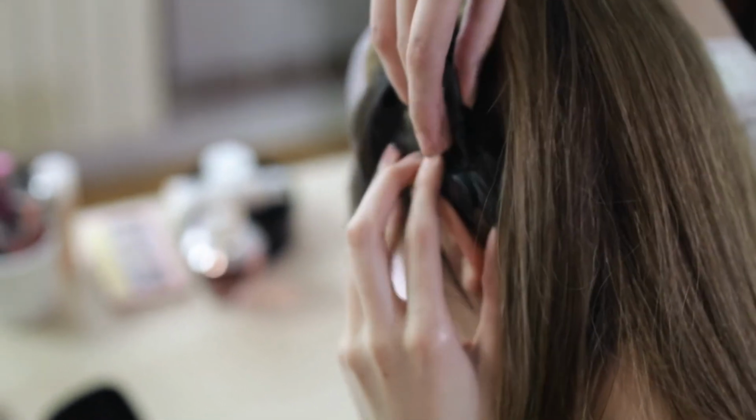They're able to use the telephone, where in the past they just couldn't even think about using the telephone. And we're seeing good sentence recognition scores. Are we curing deafness? By no stretch of the imagination is that the case. Even though we like to think of these things as bionic ears, they're still prosthetic devices, and we're still dealing with a damaged sensory organism that we're not going to be able to completely correct for.